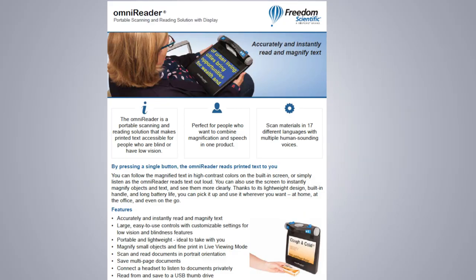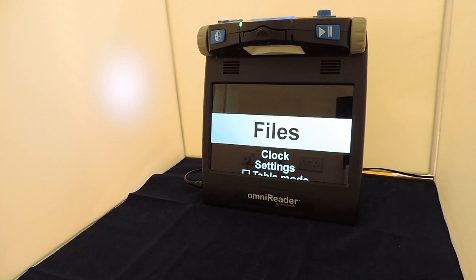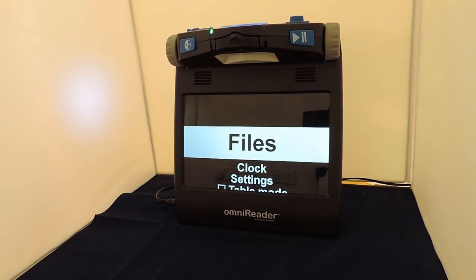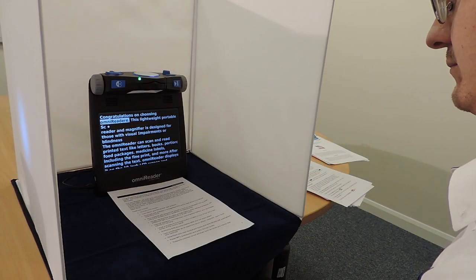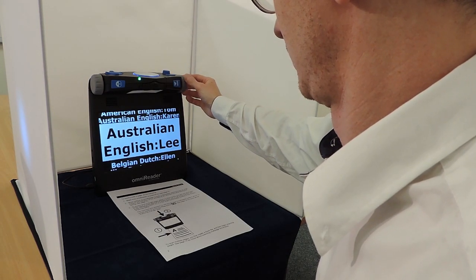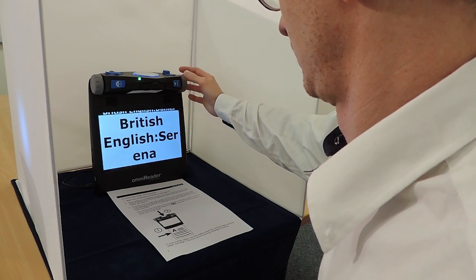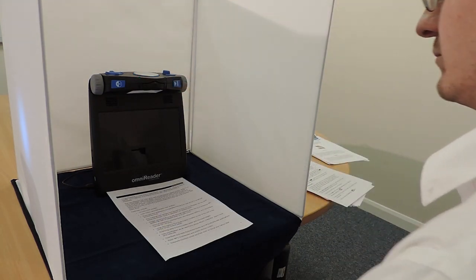Now let's move on and take a closer look at the Omni Reader. The Omni Reader reads printed text to you by pressing a single button. You can follow the magnified text in high contrast colours on the built-in screen, or simply listen as the Omni Reader reads text out loud. You can also use the screen to instantly magnify objects and text and display them in high contrast colours to see them more clearly. Thanks to its lightweight design, built-in handle and long battery life, you can pick it up and use it wherever you want — whether that be at home, at the office, or even on the go.